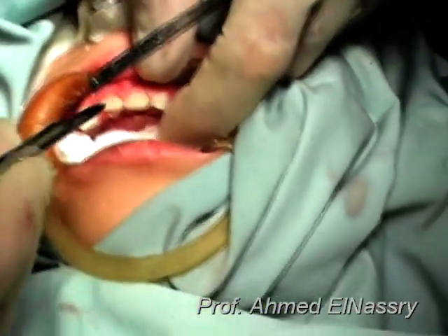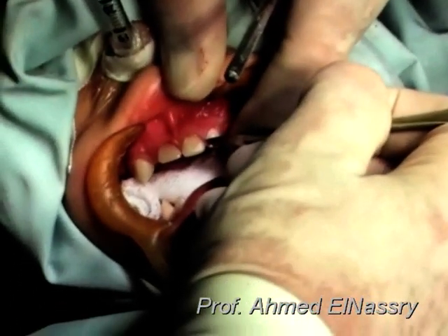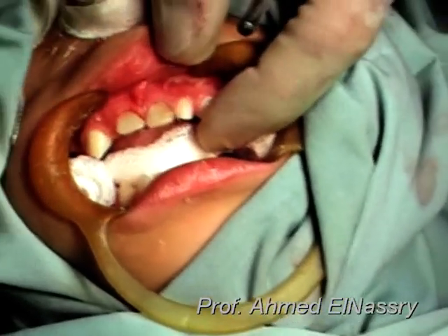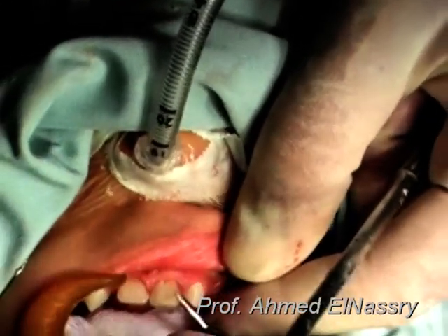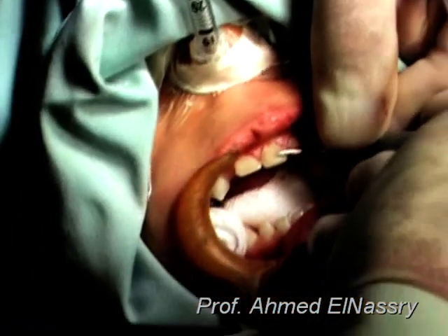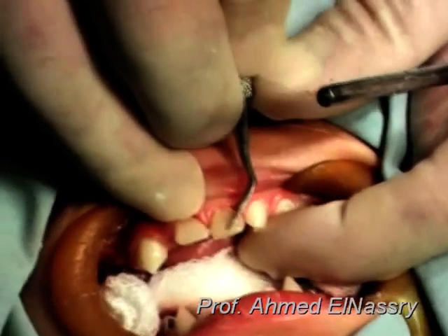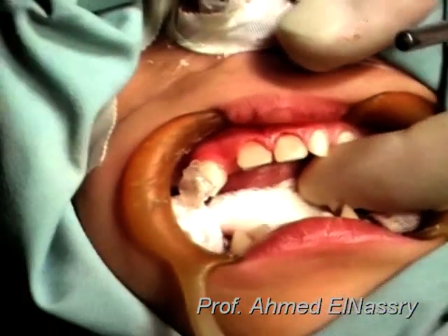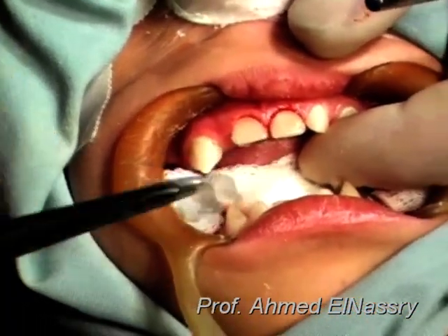After curing the composite, we start to remove the celluloid crown. This is done by incising the celluloid crown from the proximal surface over the palatal surface of the crown. Incise it by scalpel, blade number 15, and then try to separate the crown from the composite restoration by a plastic filling instrument. By this way, you can safely remove the celluloid crown.